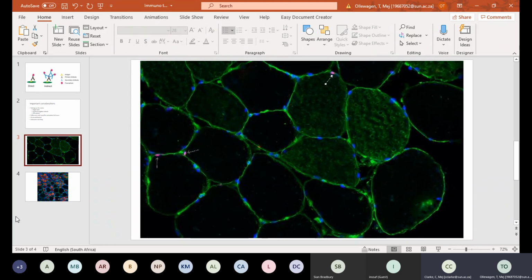Another thing that we struggle with in immunofluorescence is that some antibodies are really sensitive to freezing. So with the frozen tissue samples, we'll section and then store the samples and stain them later on. And some antibodies literally do not show up if you have frozen the tissues before staining them, which can be very frustrating to take the time to figure that out. So I would always try and use it as fresh as possible and try to section and stain at least. You can freeze it overnight and stain it the next day. That would be optimal.